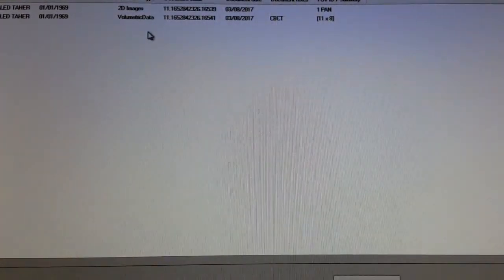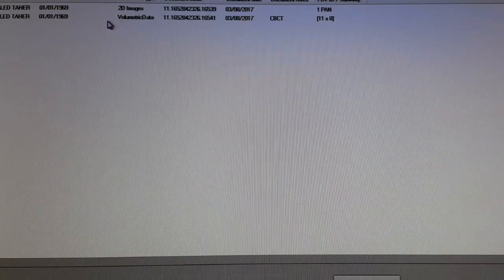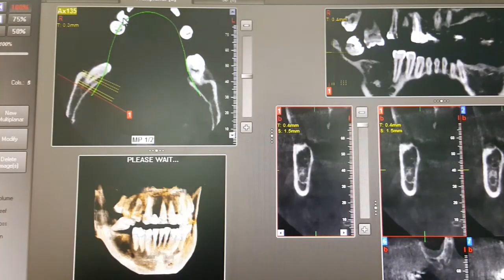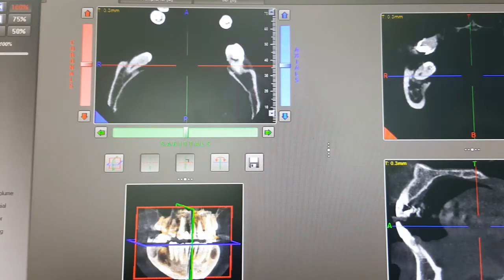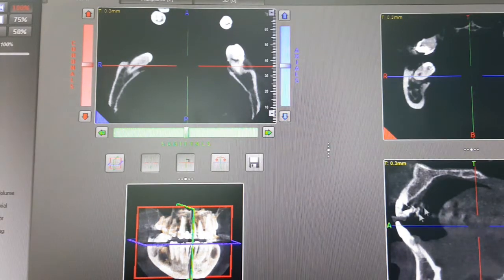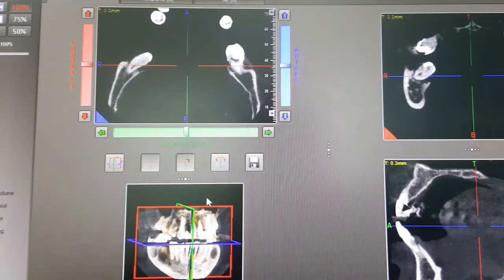You will see two things: one is the 2D image and the other is the 3D, which is the CBCT. Click on the 3D and what loads are four windows — four different ways of looking at the CBCT. This is the axial view, this is the coronal, this is the sagittal, and this is the three dimensional.